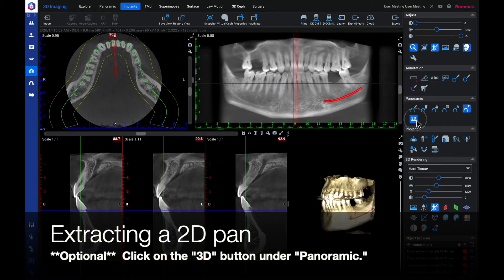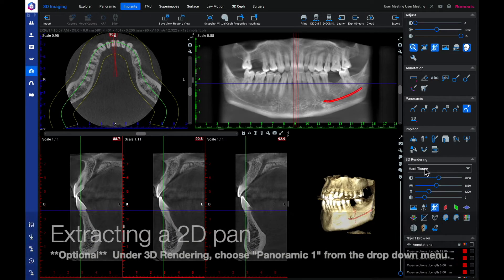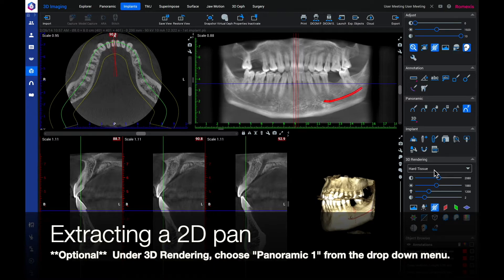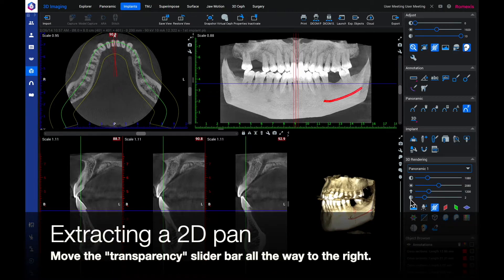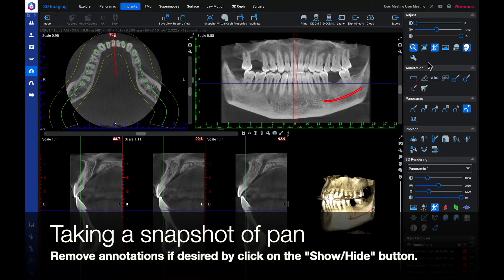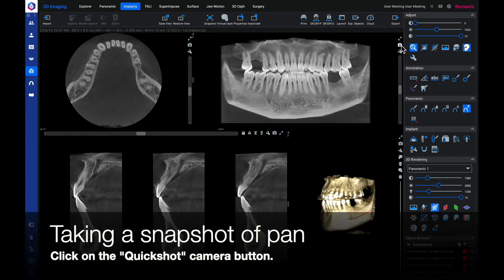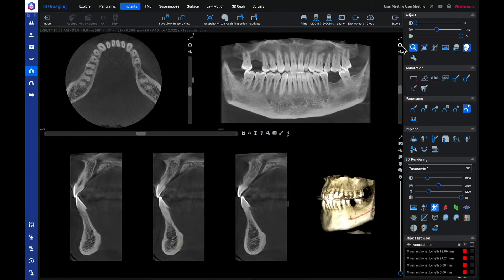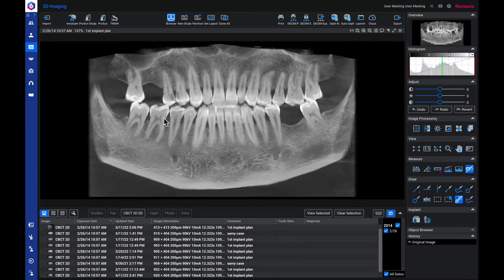The next steps are optional to increase quality for your extracted 2D pan. Click on the 3D button under the panoramic option and click on the setting MIPBW. Under 3D rendering, choose Panoramic 1 from the drop down menu. Move the transparency slider bar all the way to the right — the number will read 10. Remove annotations if desired by clicking on the show/hide button. Then take a quick snapshot by clicking the snapshot camera button. To view the snapshot, click on the 2D icon on the left side of the screen. You now have a 2D rendered snapshot of your pan.